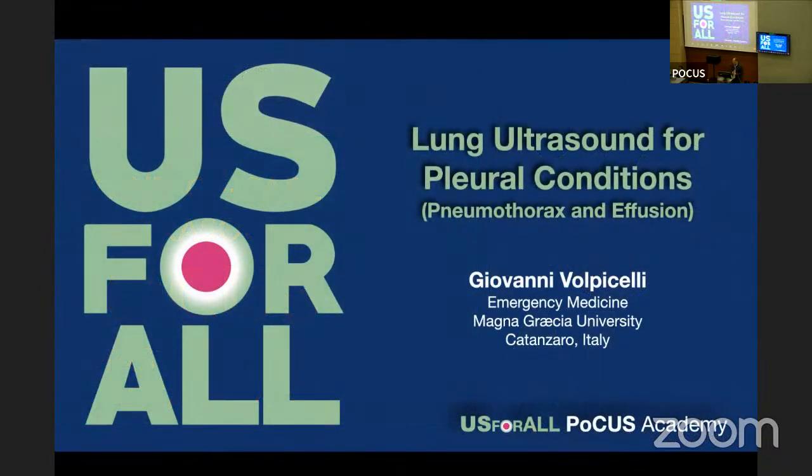Thank you for this presentation. It's very nice, and I think quite useful. My question is related to B lines, in particular about the specificity and inter-observer variability. When we assess the different lung fields and give scores to different fields, it's clear how to differentiate what's normal from what's abnormal, giving a 0 score. But when you think of B lines and giving a score of 1 versus 2, how specific can it be? Is a score of 1 given when there are 1 or 2 B lines, or if there are multiple? So we consider a range of 0 to 10, how specific can we be in that?